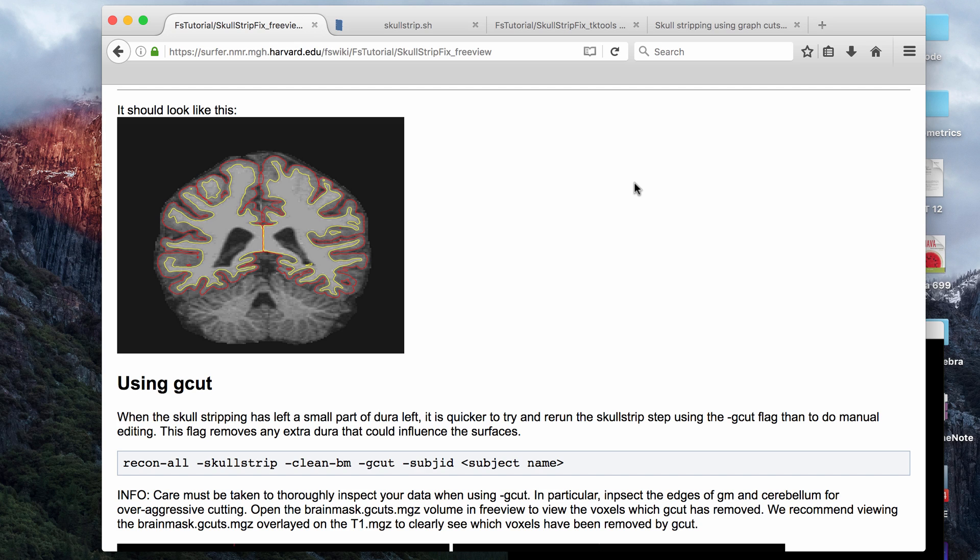In the last video we talked about how to manually edit the brain mask, but I said that if your brain has a lot of errors, it might take a long time if you just try to fix them manually. Fixing a bad skull strip can take over an hour if you just go into it from the automatically produced brain mask.